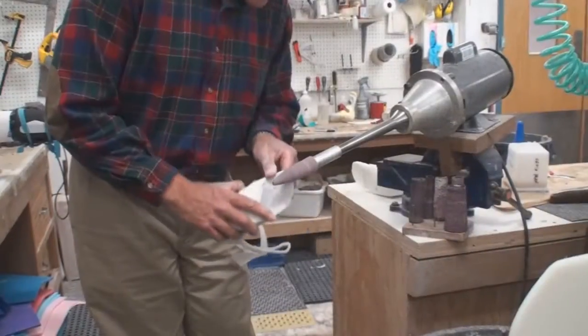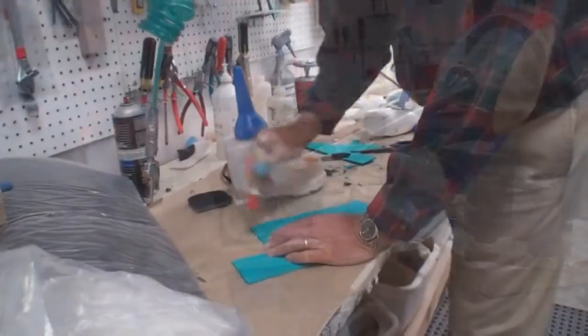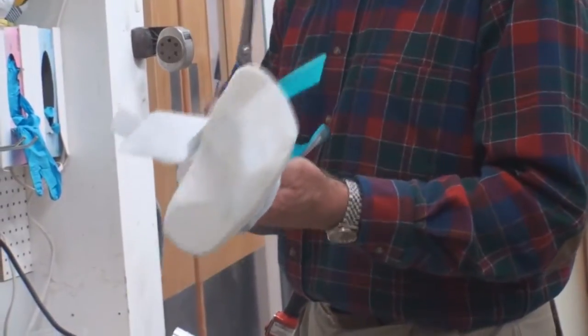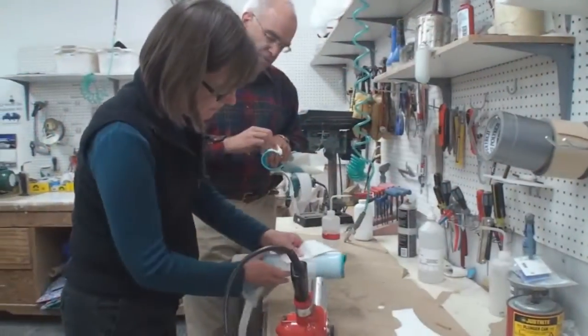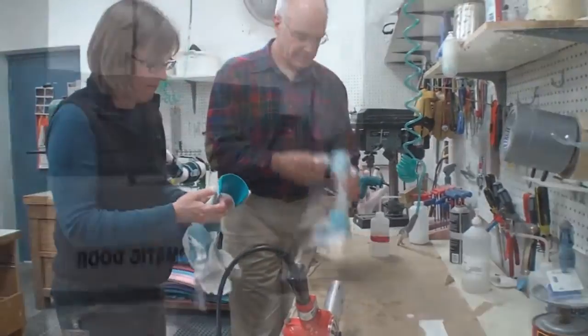That mold we create from the cast is used to fabricate the actual brace. The foam pads are put in place for comfort. The plastic is pulled to create the stability and the flexibility of the original design. All of that is done with the anticipation that it will work.